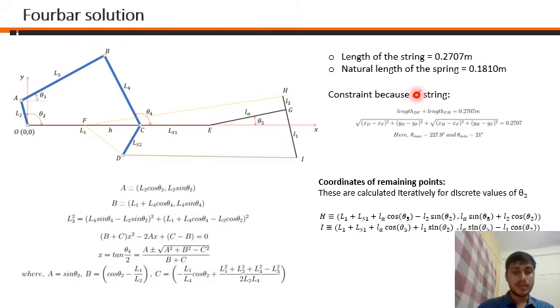What happens is that when theta is greater than 90 degrees, it pulls the wire, and because the length of the wire is constant, the knee is bent. On the other hand, when theta is less than 90 degrees, the spring is stretched to provide more stiffness to the knee.